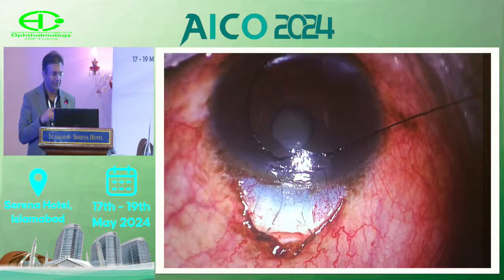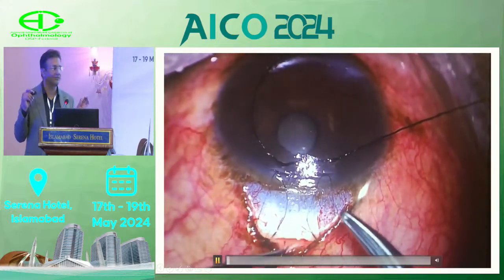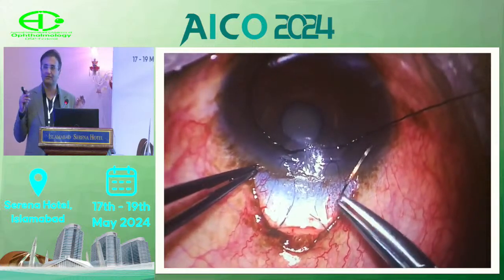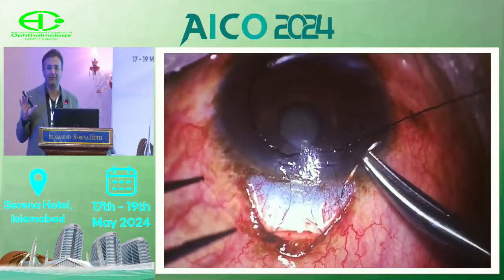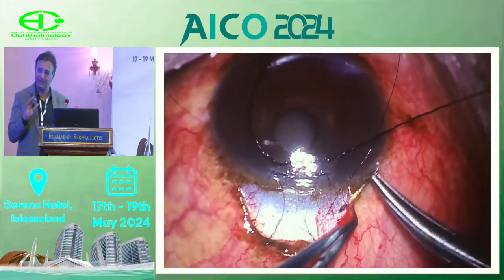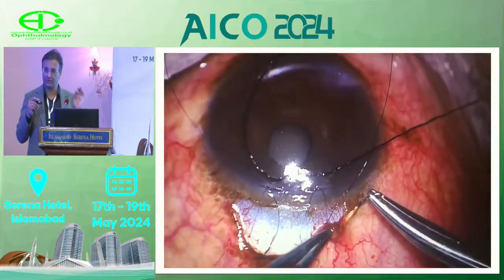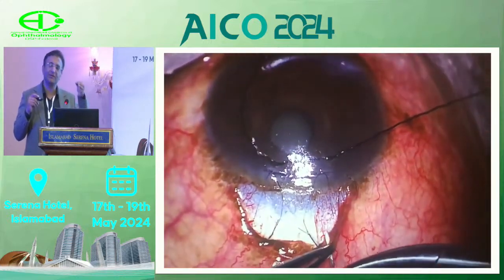And this is also very important कि भाई जब आपने कर लिया, इतनी मेहनत की है, इसके बाद आपने क्लोज कैसे करना है. अगर आपकी कॉन्जंक्टिवा फ्लैप से लीक हो रहा है तो that means your trabeculectomy failed. A leaking bleb will lead to almost 100% chance of bleb failure later or sooner. और जब भी आपने क्लोज करना है you need to close in 2 layers. आप 2 layers में या 1 layer में करें.